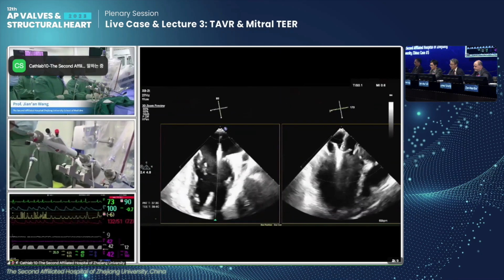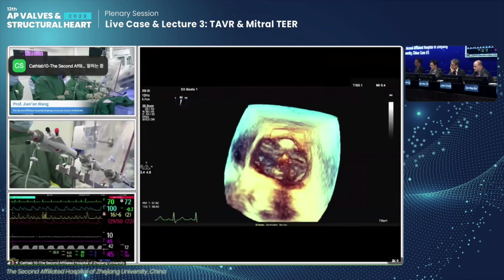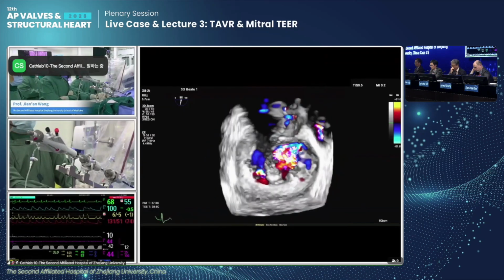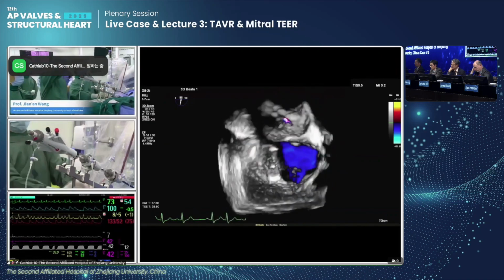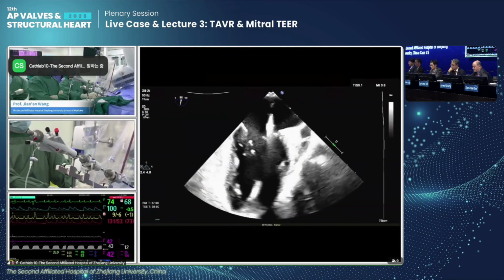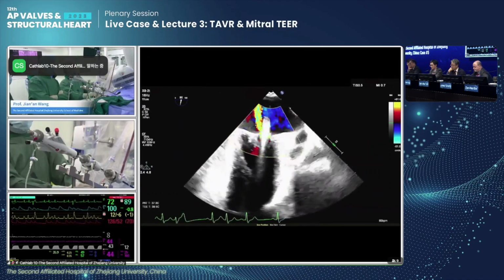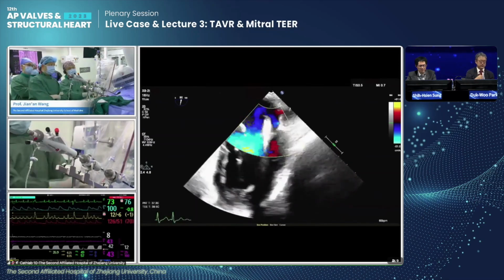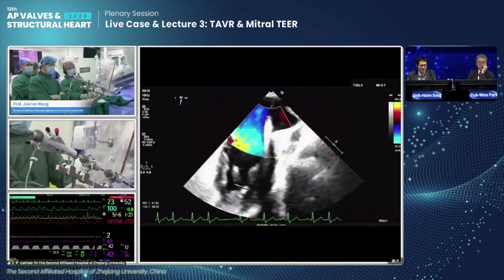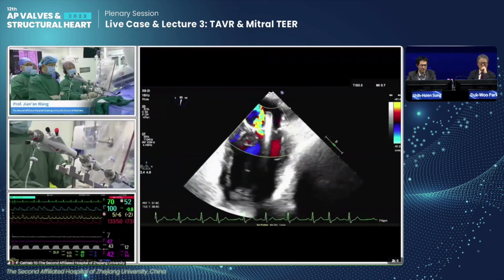We are worried about when the device goes down to the left ventricle; it would be too much clockwise. Check the color again in 2D. What do you think of the position? We need more medial. Lateral is missing the jet. Just would like to get the correct orientation because you have a long arm clip. While diving into the left ventricle, it might not be easy to retrieve it.